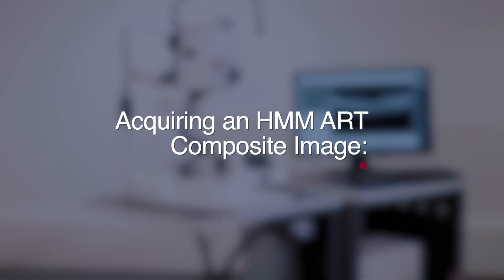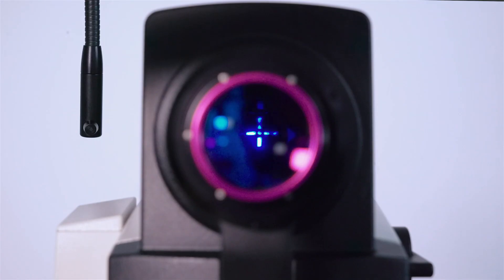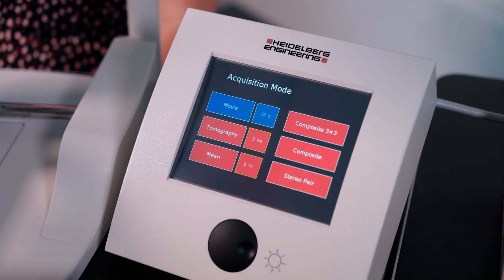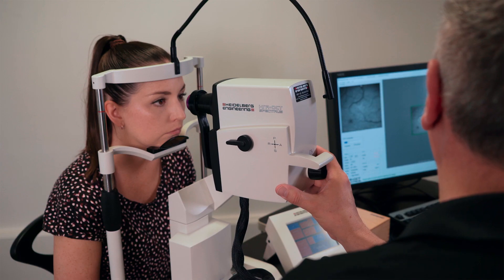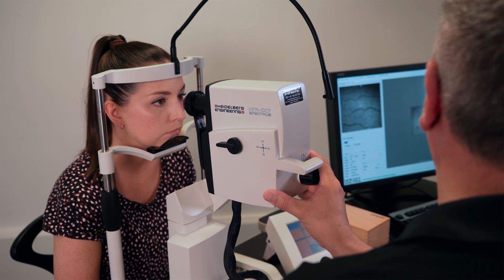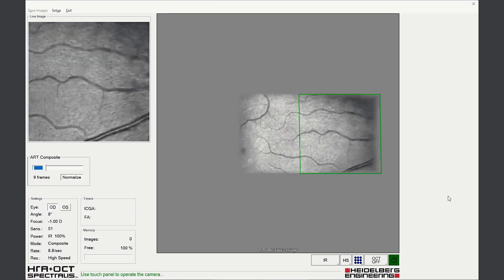Acquiring an HMM ART composite image. The external fixation target should be selected. The camera head aligned and focused using the technique described previously, and the composite mode selected. Eye tracking should be engaged and the camera head panned, constantly adjusting the fundus illumination to create a wide field panoramic high magnification image.